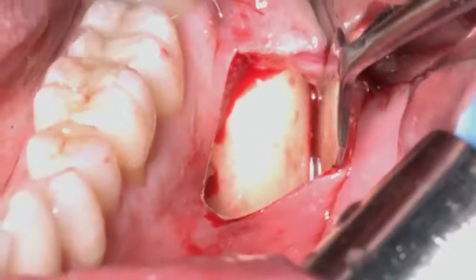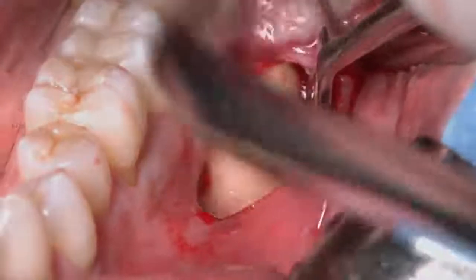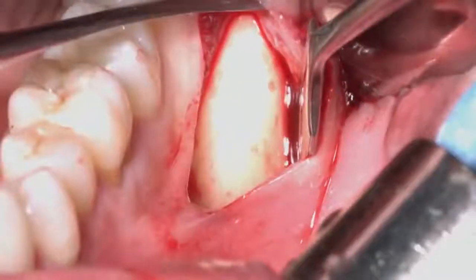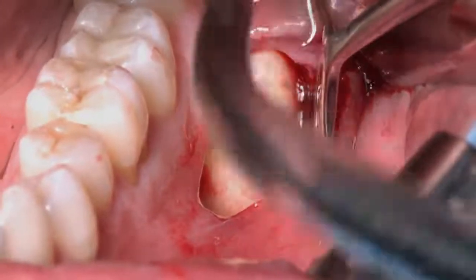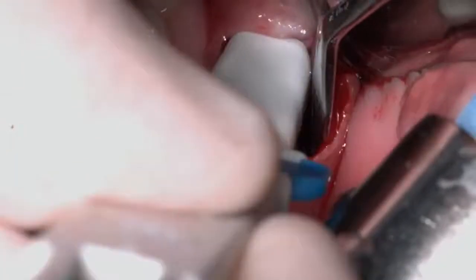This is a small elevation because here we need to use only the safe scraper to get a little amount of bone for minor regeneration. But if you need a block or a bigger amount of bone, you can go toward the distal side and expose all the mandibular ramus until the coronoid process.